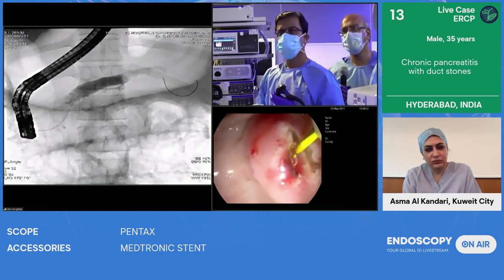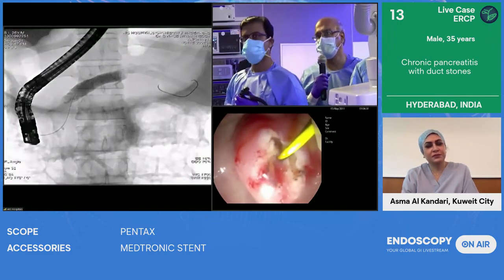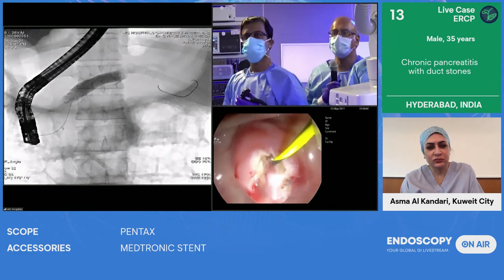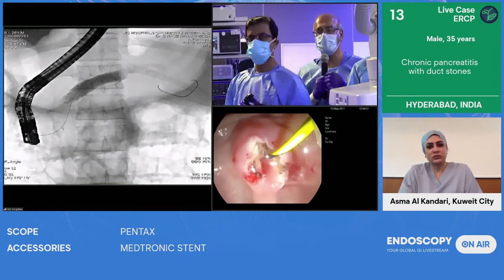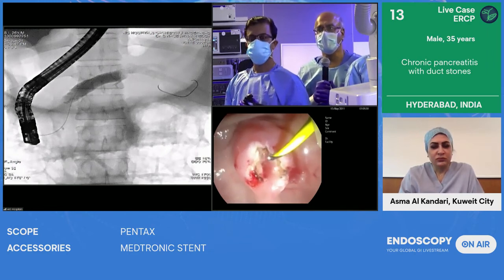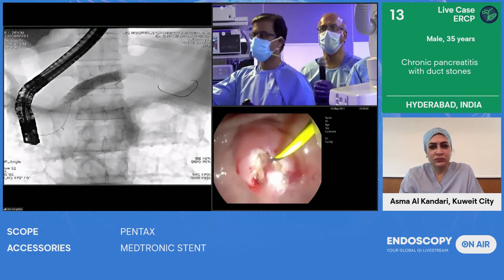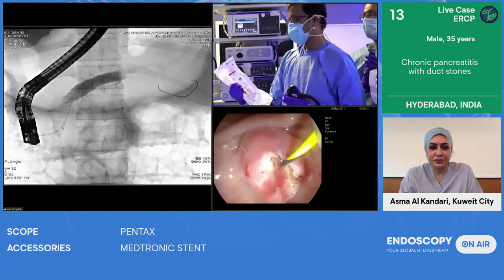One of the things that we've been doing, Asma, now in patients with chronic pancreatitis is to do this sphincterotomy, not a huge one, but like a 5 millimeter one as in this case, and then use a Titan balloon or one of those hurricane balloons to actually dilate it. Now, the reason why this is important is that unlike a standard pancreatic or biliary sphincterotomy, most of these patients with tropical chronic pancreatitis that we see here have a small prepapillary stricture. And once we do a balloon dilatation with one of these hurricane or Titan balloons, you can open up not only the sphincter but also the prepapillary stricture. Yes. Okay.